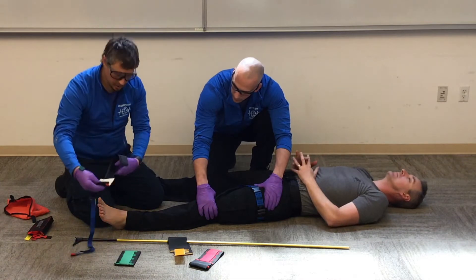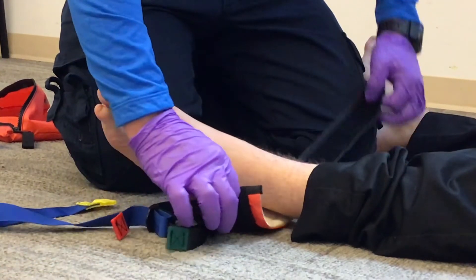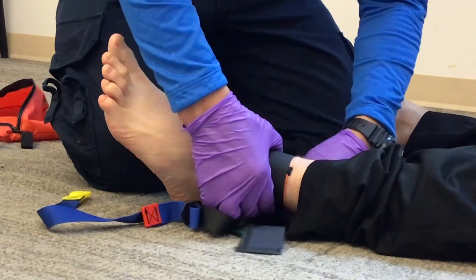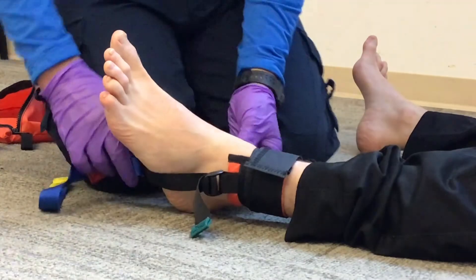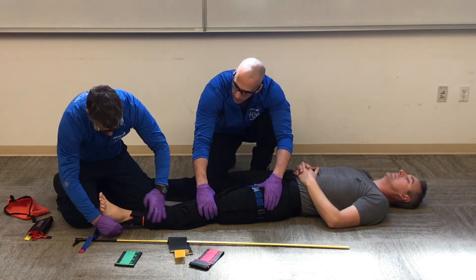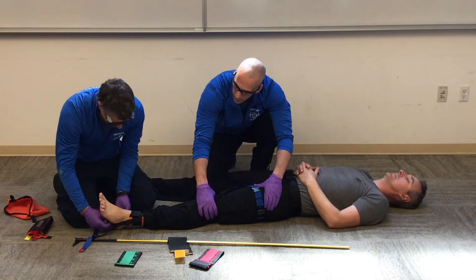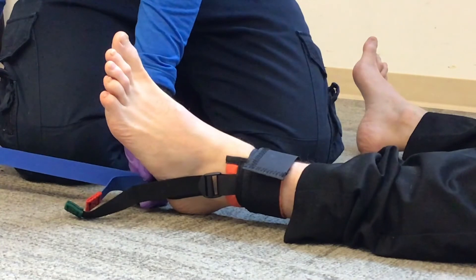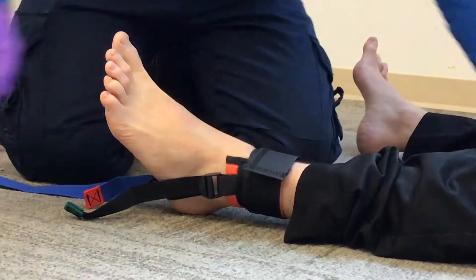I'm going to secure my ankle hitch. I'll slide this right under the back of the ankle in that little gap, and I want this tight right above the medial and lateral malleolus. My heel strap goes right under the heel, and that's going to put this right in line with the tib-fib. I can pull the green strap tight so that my heel strap runs tight along the heel. I can loosen up my strap so that I have a big distance on the yellow piece and a little space on the red piece.